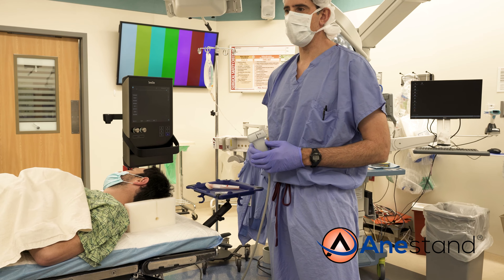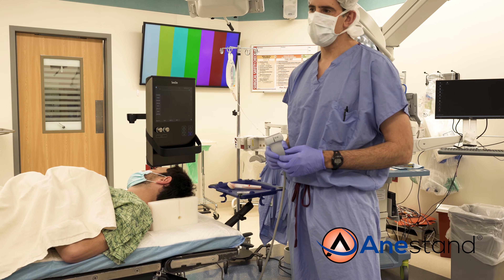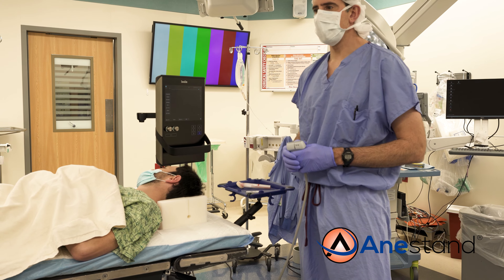Regional anesthesia is an expanding part of every provider's practice. Nerve blocks are performed in a variety of locations — some in the holding area, some in the PACU, and others in the operating room.